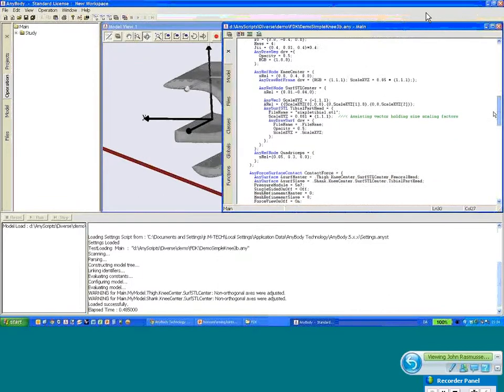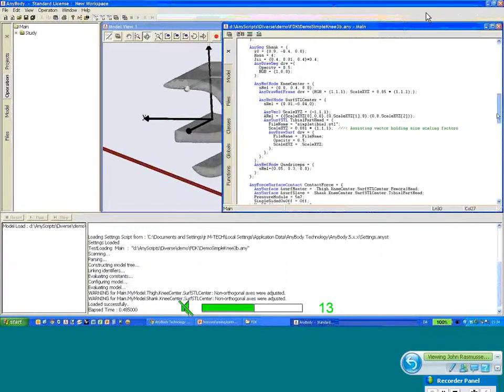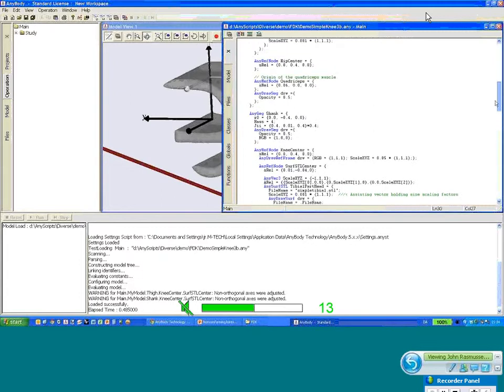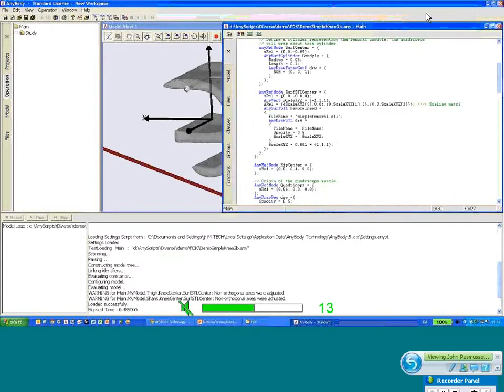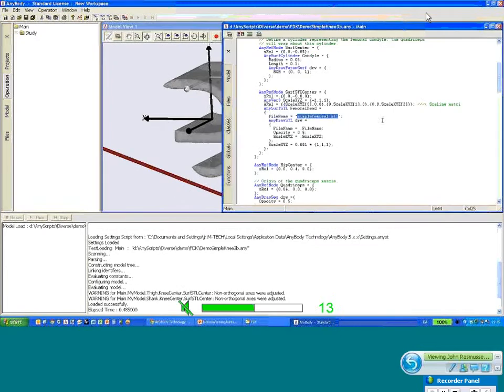But you can see here that we have defined an AnySurfSTL. This is the tibial part here. And also in the femur, there is up here an AnySurfSTL, which is the femoral head. And those are the two surfaces which have been imported. They are saved as STL files. You can see here is the name of the STL file of the femoral part. So the only thing you have to do is actually to save those two STL files and then import them into the model like this.